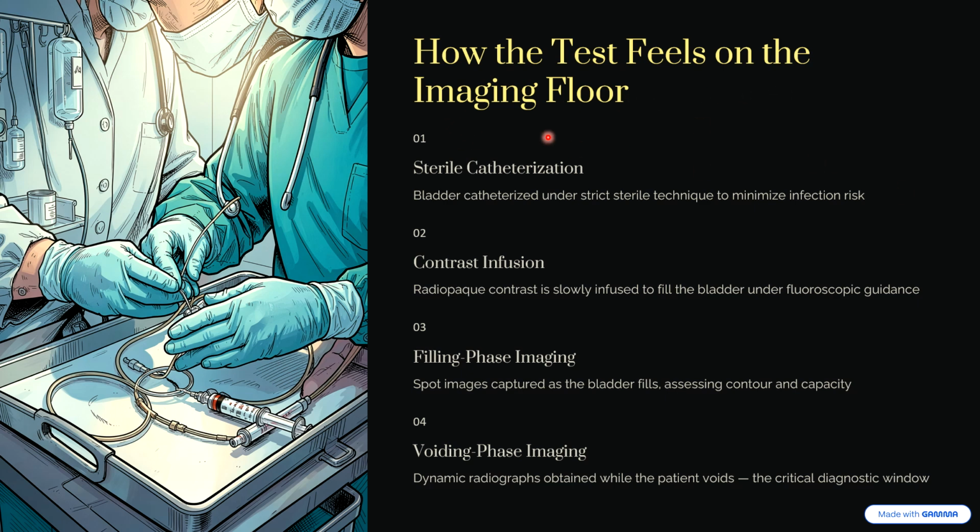How the test feels on the imaging floor. So what are the steps? Number one is sterile catheterization. That means a catheterization of the bladder is done with minimum infection, so the total environment will be sterile. Number two, contrast infusion. Radiopaque contrast is slowly infused to fill the bladder under fluoroscopic guidance, which will guide us to know how the bladder works when it is filled.